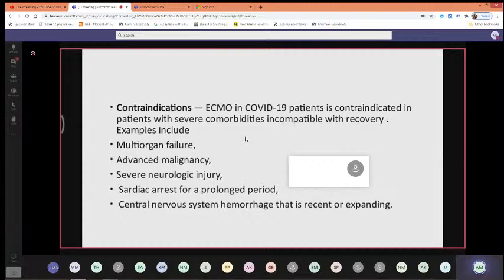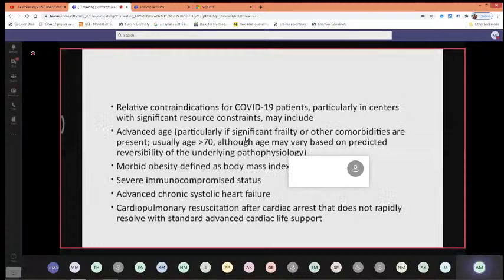The contraindications are multi-organ failure and advanced malignancy, because you're not going to make much difference by putting them on ECMO for a long time. Once patients go on ECMO, they take 1 week, 10 days, or 2 weeks to come out of it. If it is a really young patient without complications, they do come out. Heart failure and cardiomyopathies are the relative contraindications.